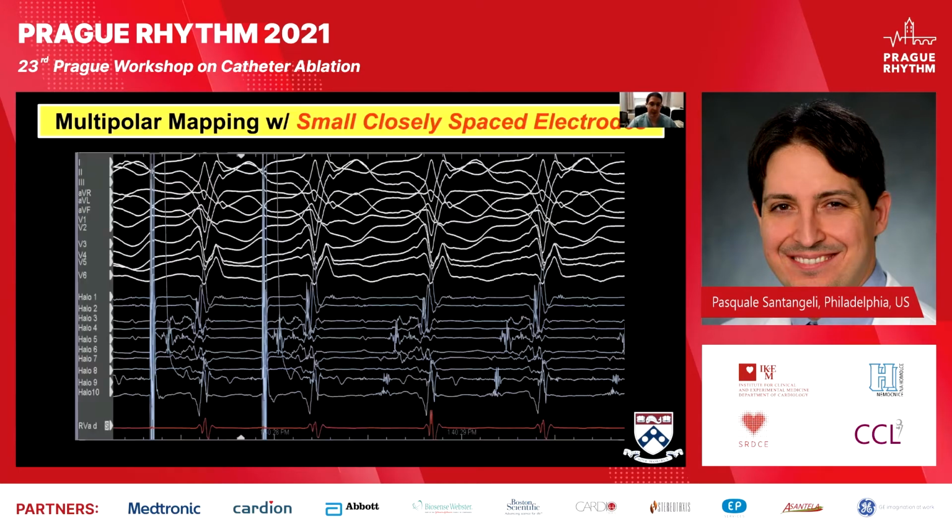The definition of the diastolic pathway has also been helpful to plan the procedural approach and possibly improve the outcomes. In addition to better activation mapping, having small electrodes with tight inter-electrode distance also allows for a more near-field capture during pacing or entrainment. Like in this example, where you can see orthodromic capture during entrainment of pretty much the entire diastolic pathway, with concealed QRS fusion, the VT has been accelerated, and perfect PPI. So again, small electrodes with tight inter-electrode distance help to capture the near-field electrogram components during entrainment mapping, and facilitate measuring the post-pacing interval.